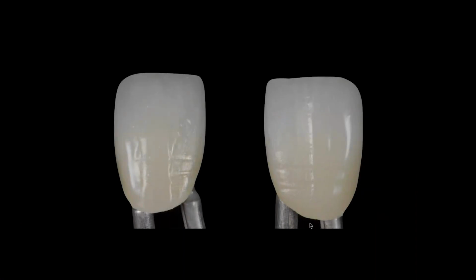So again, another way to think it through, this is where the challenges are coming in more in the monolithic world: how much depth and topography do we want, and how much of it will we lose when we go over this with a glazing paste in the monolithic world. It's not an easy system. It's a little more challenging.